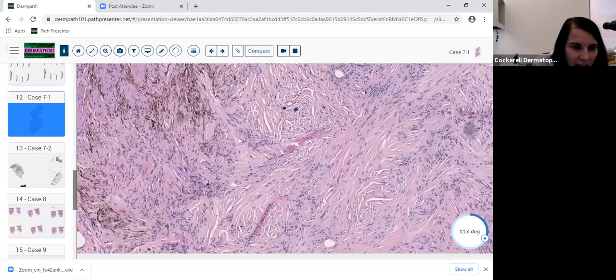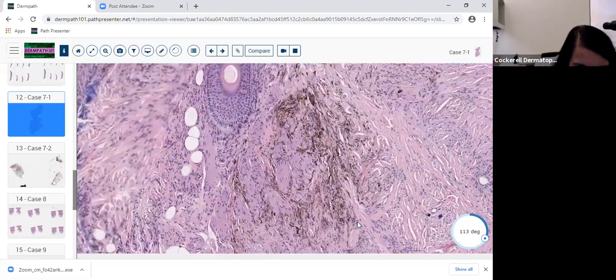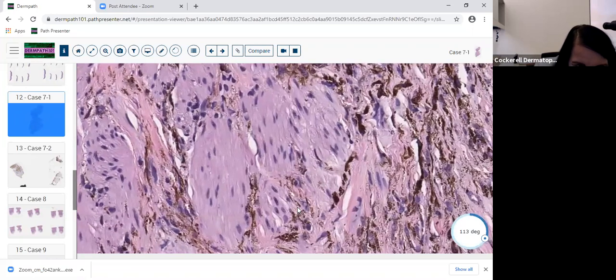This isn't a combined nevus or anything like that, because blue nevi can be combined with intradermal nevi, junctional nevi, compound nevi, and Spitz nevi. So it doesn't have that. But it has this Schwannian differentiation here. And this is what I was trying to find before. You see how it looks sort of spindled there and neurotized?